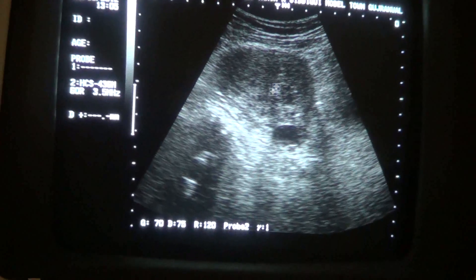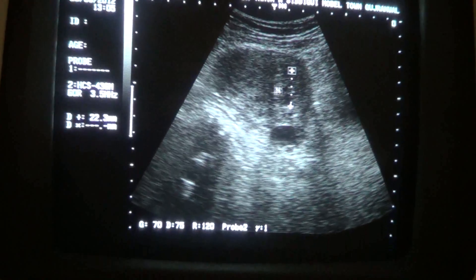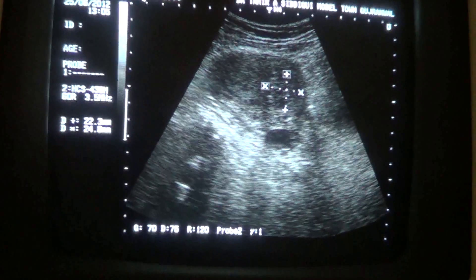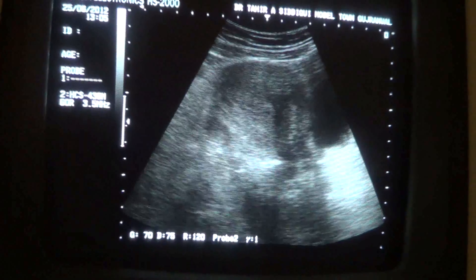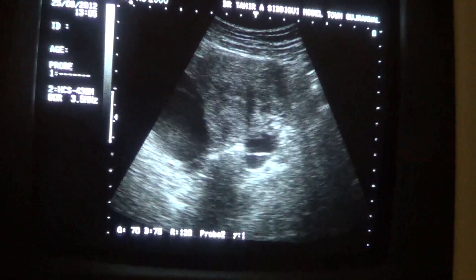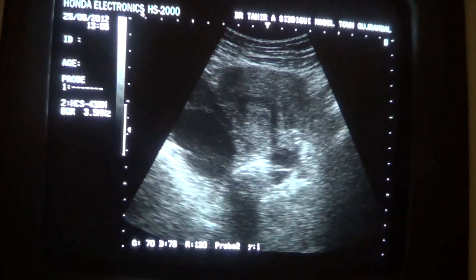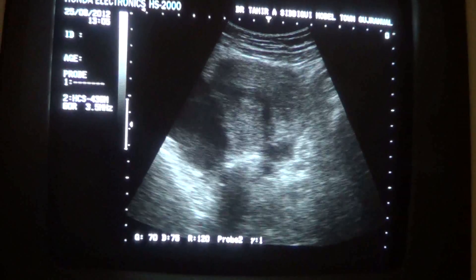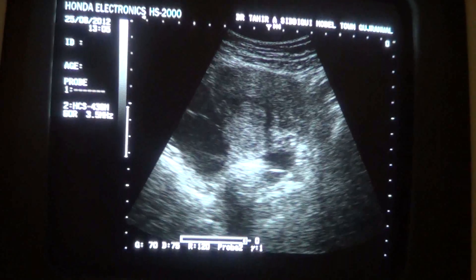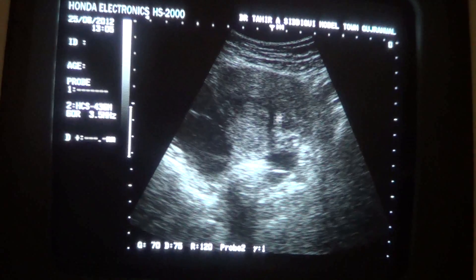This is the fibroid in this area. It measures approximately 22 by 24 mm. In the transverse section, you can see the fibroid again alongside the central clear endometrial canal. It gives no distortion effect on the central endometrial canal.